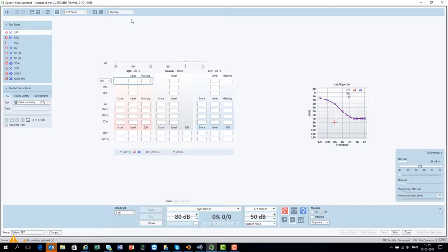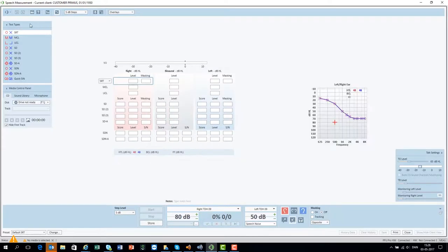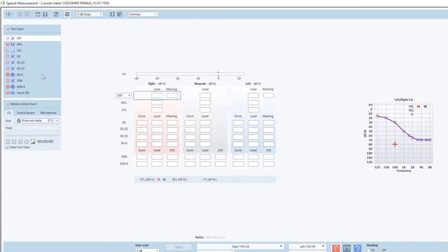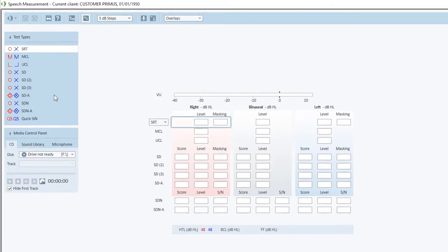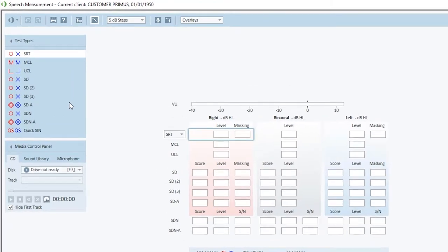where you can toggle the pure tone audiogram on and off in the speech audiometry screen. In the upper left hand side you will find the test types, for example the speech recognition threshold, the most comfortable level, and the uncomfortable level.